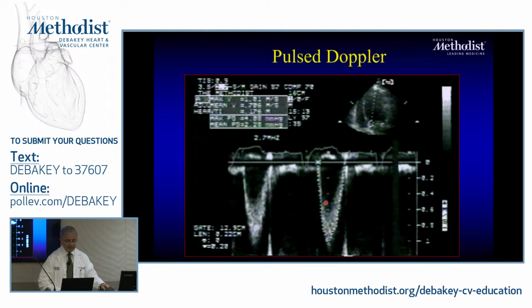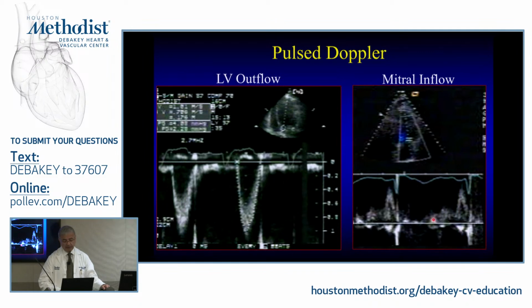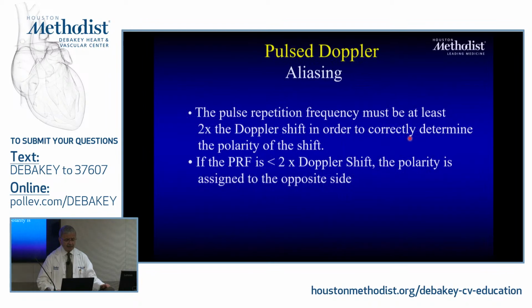Okay? So this is an example of pulse Doppler in the LV outflow tract. You can see the velocities. The red cells, this spectral display that you see, we call it spectral broadening here, because here it's not broad, but it gets broadening here. Here meaning all these red cells at that area are going at that speed. But at maximal speed, there's some dispersion. Some of them are going a little faster than others, and this is where you see the spectral dispersion of it. And then flow ends at the end of ejection, and you can have the same thing in the mitral area where I put my pulse Doppler either at the annulus or at the tip to get my diastolic flow. Okay?